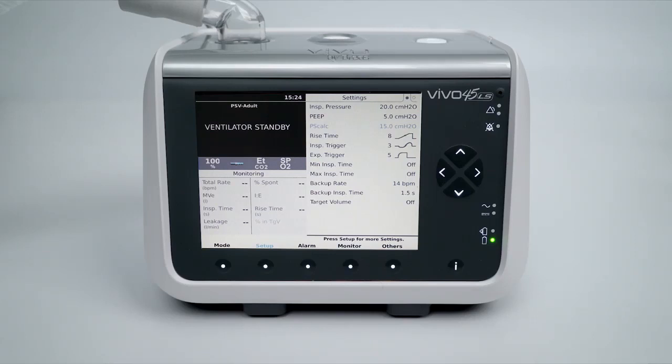The inspiratory time settings, which vary depending on the mode in use. The min and max inspiratory time settings are important for patient ventilator synchrony. During pressure support, the patient has the control of initiation and cycling of a breath. When ventilator asynchrony occurs due to lung compliance, lung disease status, or patient-related issues, setting a minimum or maximum inspiratory time can be clinically significant.